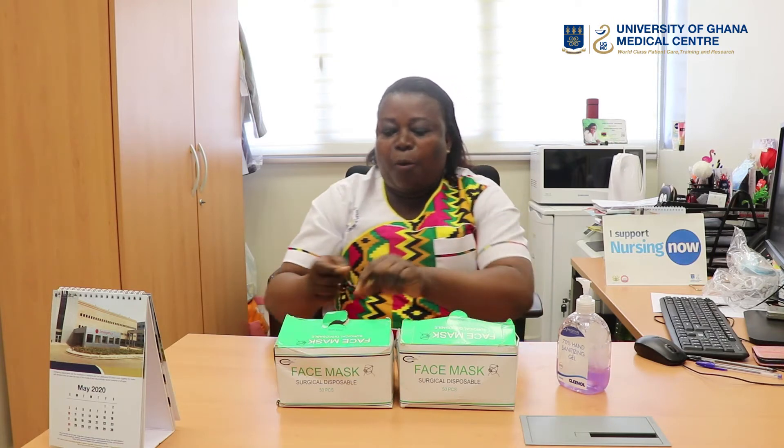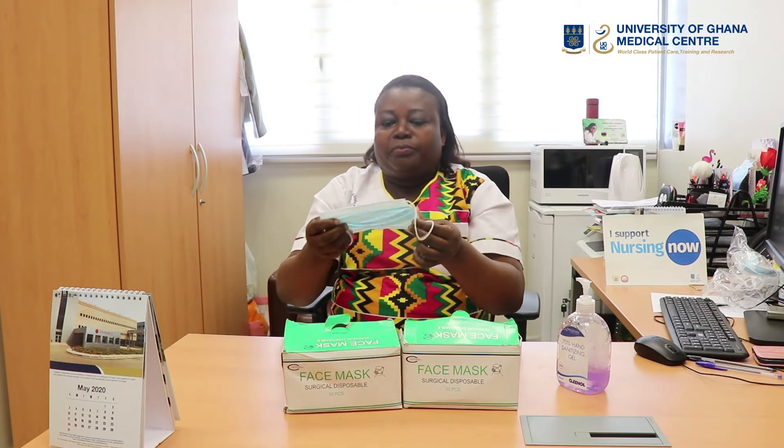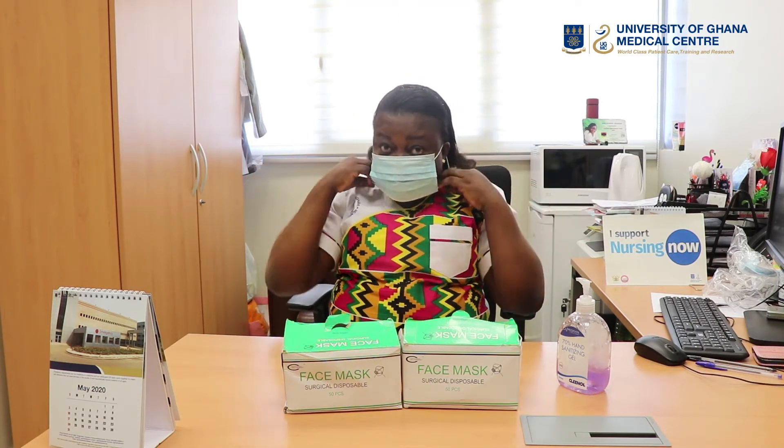The next one I'm going to talk about is the loop type. I've sanitized my hands already, so I'll pick my loop face mask. After picking it, I will locate the string — it's very important, because that part will fall on the bridge of the nose. So always it should be upwards. I'll hold the loops together and put it on my face, then hook it on my two ears.